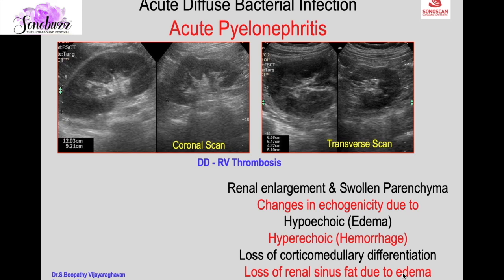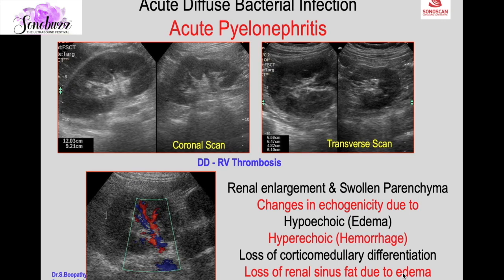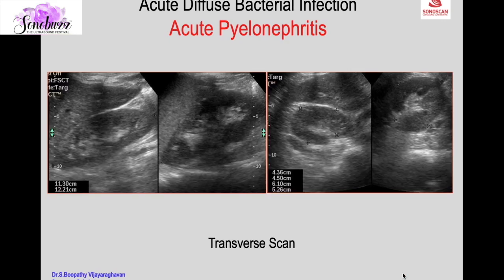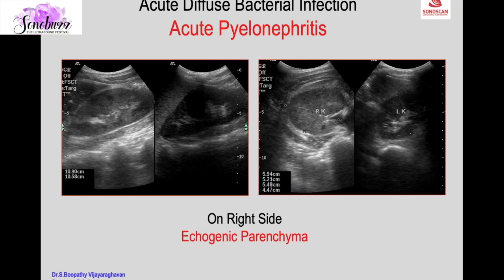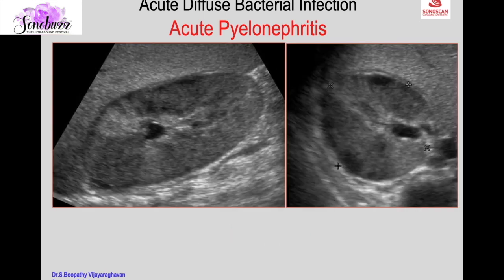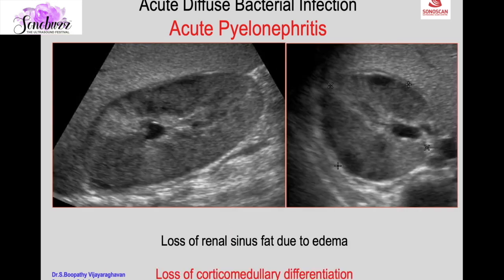The differential diagnosis is renal vein thrombosis, so a color Doppler will rule out renal vein thrombosis — renal vein flow is normal here. Swelling of the parenchyma is better appreciated in the transverse scan; the coronal scan may look almost normal whereas the transverse scan shows the swollen parenchyma. Echogenicity may be echopoor or echogenic, and along with clinical features we diagnose acute pyelonephritis. Swelling with compression of the central echogenic area and loss of corticomedullary differentiation are characteristic features.